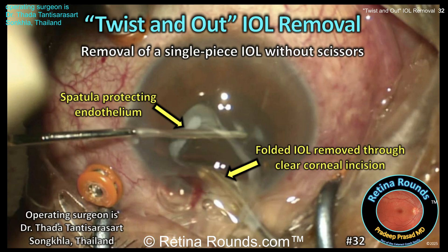This is going to be a technique that's familiar to the Cataract Coach viewers, as this technique was first described by Drs. Pandit, Devgan, and Chapman back in 2020. We'll go ahead and run through the case at full speed, and then we'll show it at half speed so that we can break down each step in more detail.